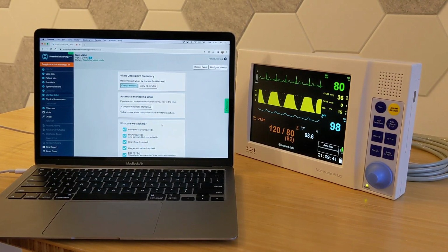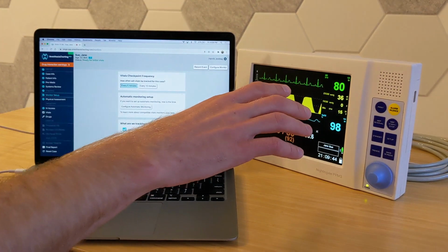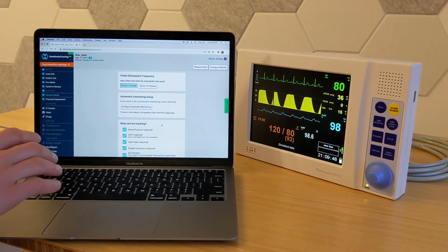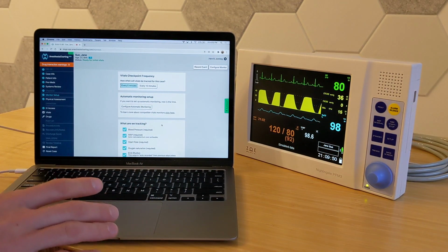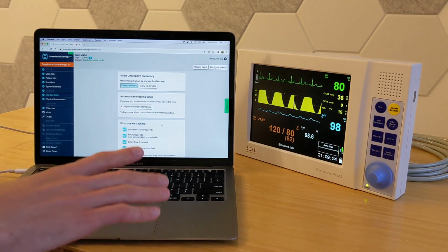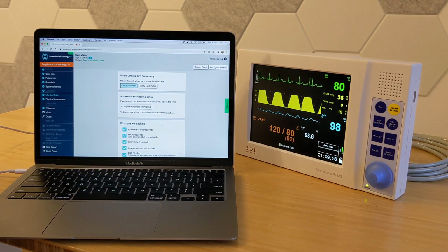I'm going to do a quick demo showing how to connect the Zoe Medical PPM3 monitor to the anesthesiacharting.com software. So what I have here is just any computer capable of running Chrome should be just fine, as long as it's a real computer like a laptop or desktop. Running the latest version of Chrome, you should be good to go.